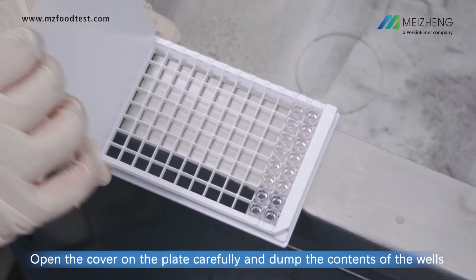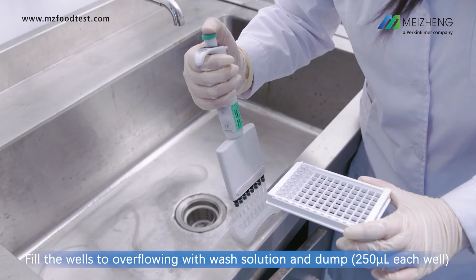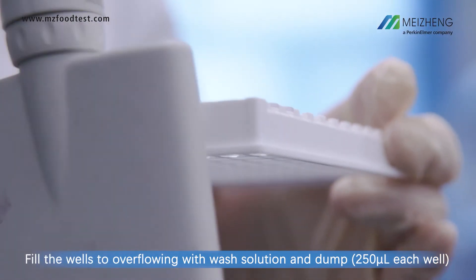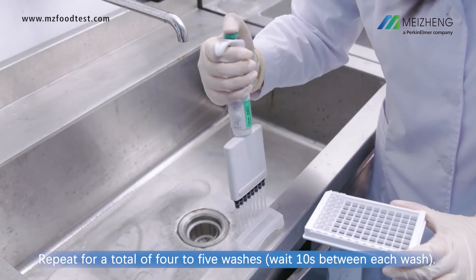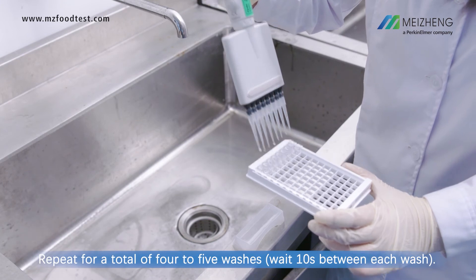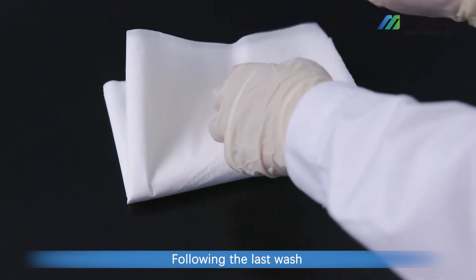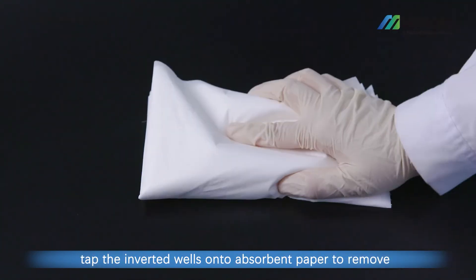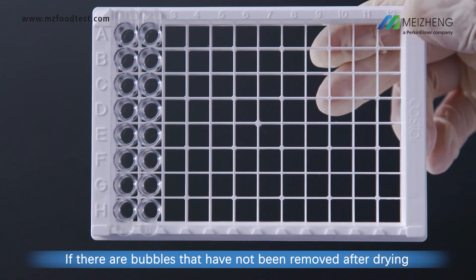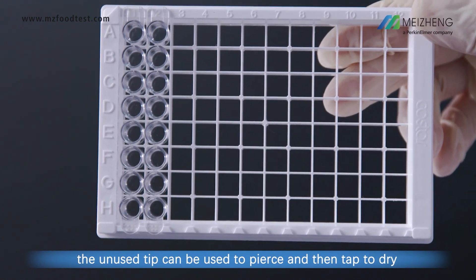Open the cover on the plate carefully and dump the contents of the wells into an appropriate waste container. Fill the wells to overflowing with wash solution and dump. Repeat for a total of 4 to 5 washes. Following the last wash, tap the inverted wells onto absorbent paper to remove remaining wash solution. If there are bubbles that have not been removed after drying, an unused tip can be used to pierce them and then tap to dry.